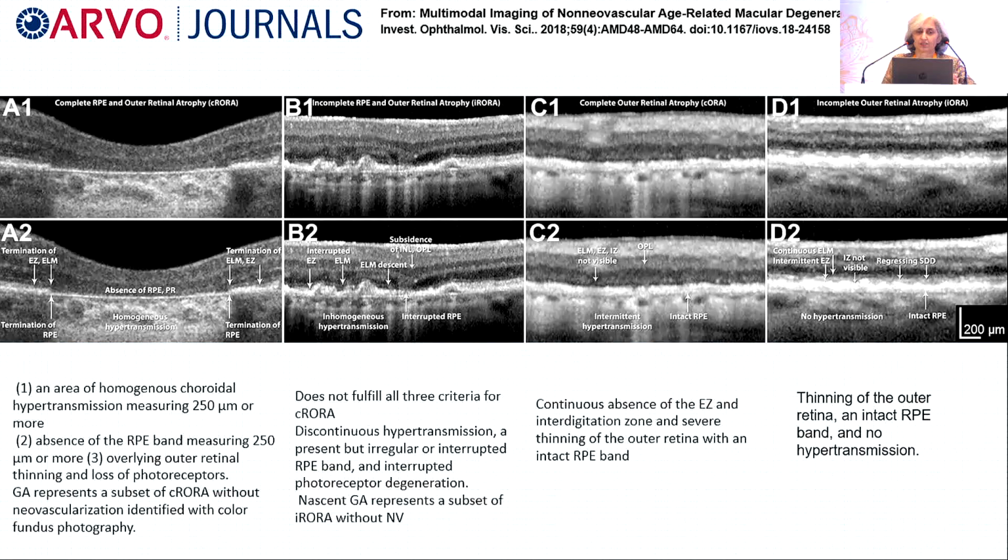And this was the study which showed the OCT findings of incomplete outer retinal atrophy progressing to complete outer retinal atrophy.